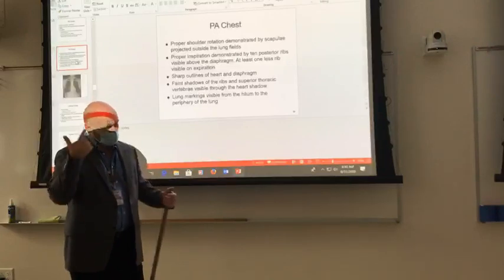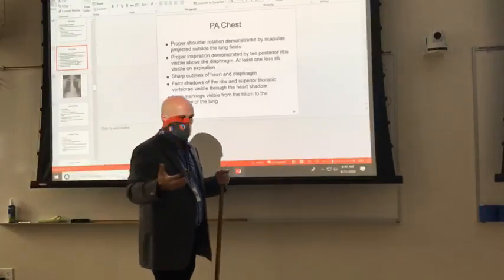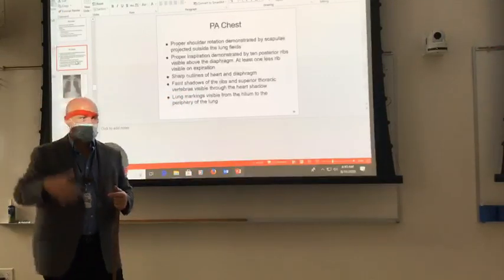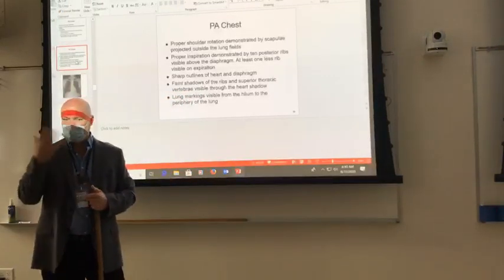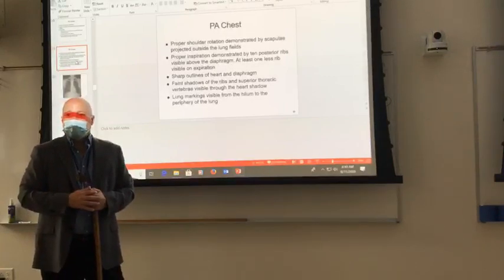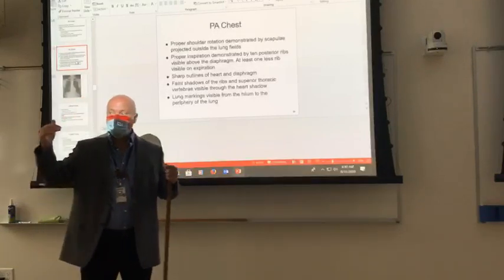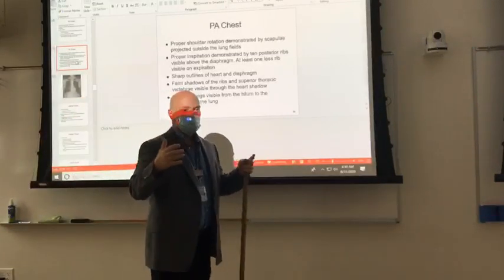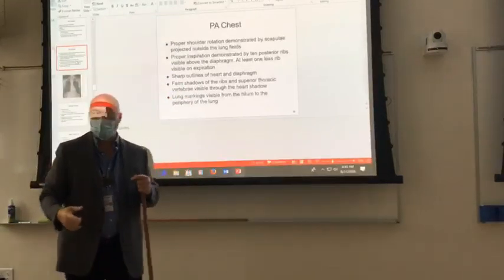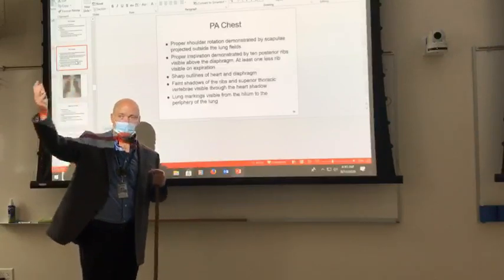Y'all might, I don't have hair to make it look fuzzy. Y'all's might look a little fuzzier than mine does, but why is that? Your head is 5 to 6 feet off the ground. Why does it not look fuzzy? It's closer to the light. Well, you're on the right track. It might look a little bit fuzzy, but it's not this fuzzy, right? And why is that? Because the light is 40 feet up on the telephone pole. So your SID is quite high.